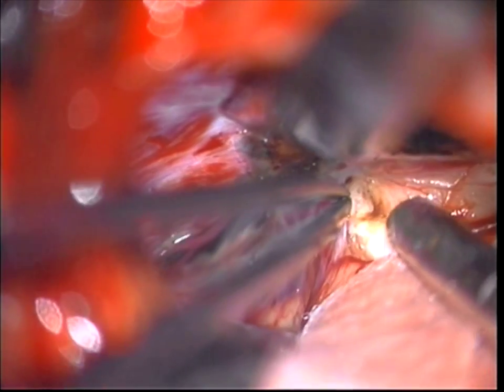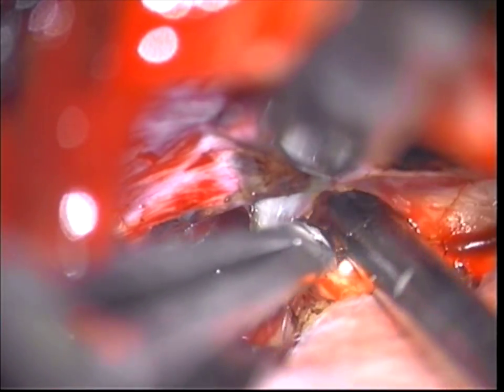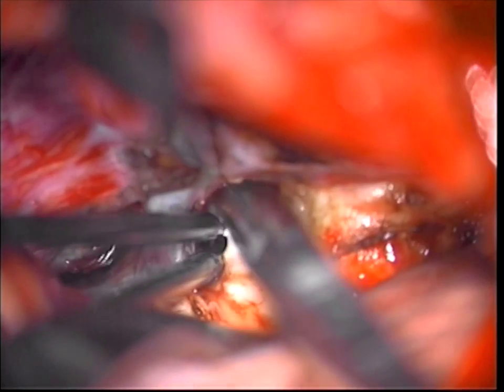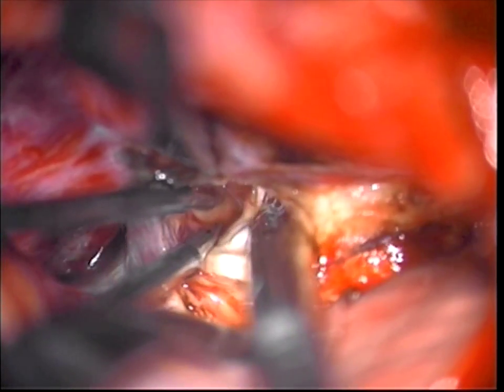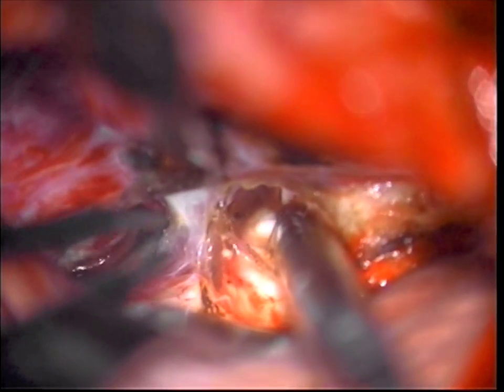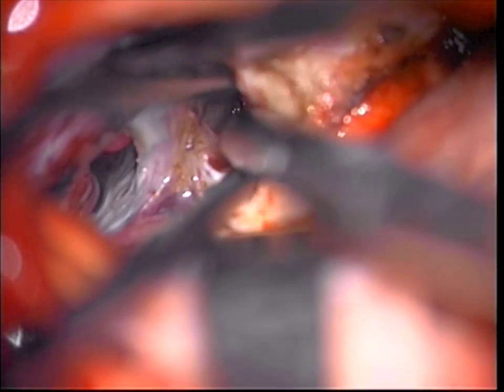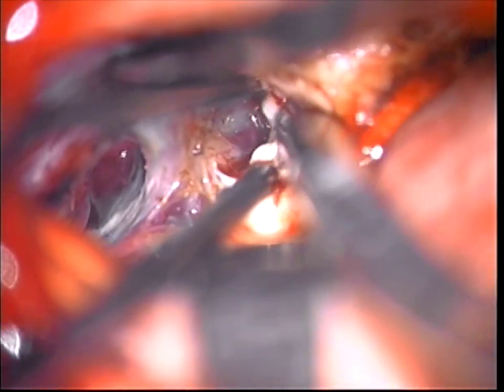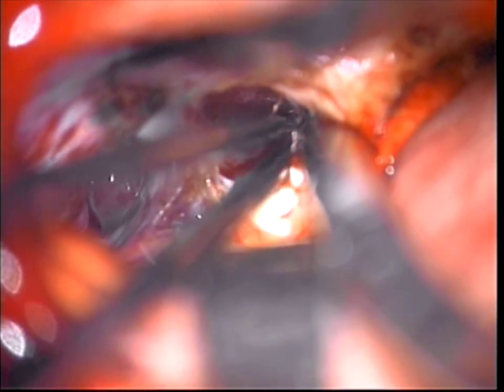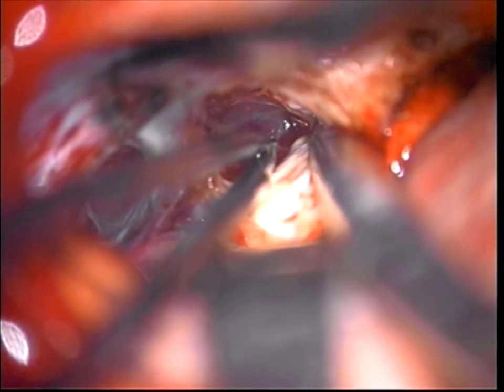Smaller lesions that are deeper are technically a little bit more difficult. Here we are going just underneath the corpus callosum. In these cases, the internal veins are superior to the tumor, and that's why you have to be cautious. We went above on that side, just below the corpus callosum. Trying to make that aperture a little bit bigger, taking some of those bridging veins off. We keep using the stealth — that's very important. And now we get a little glimpse of the tumor right there, deep in there.